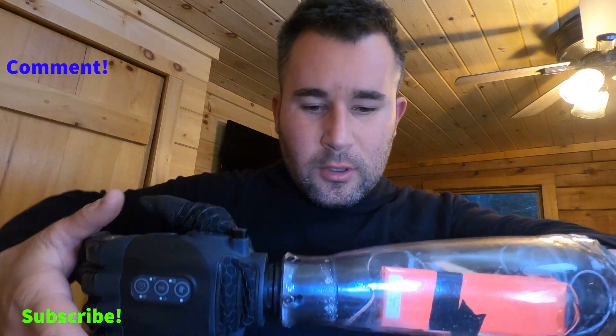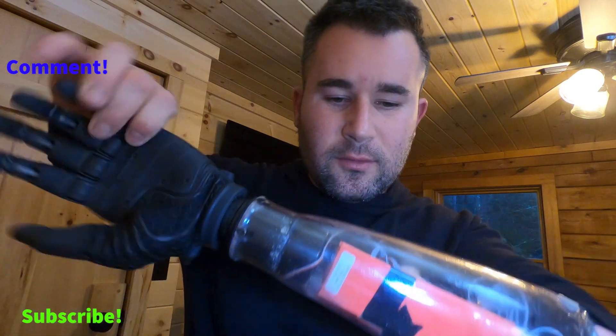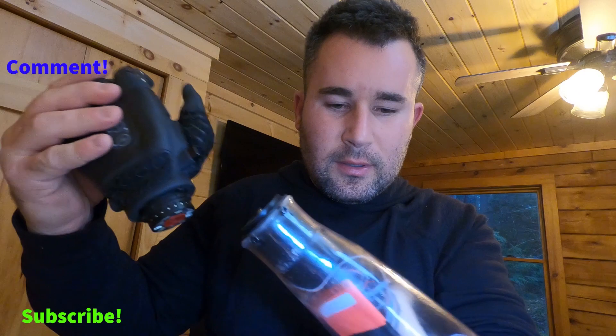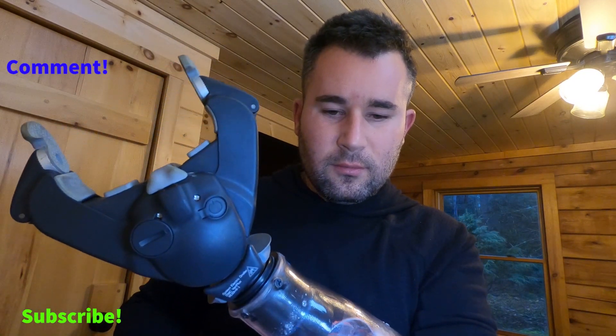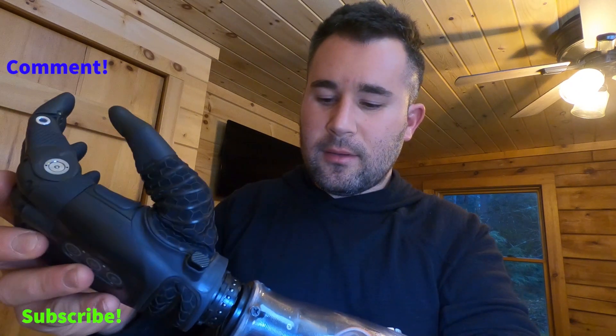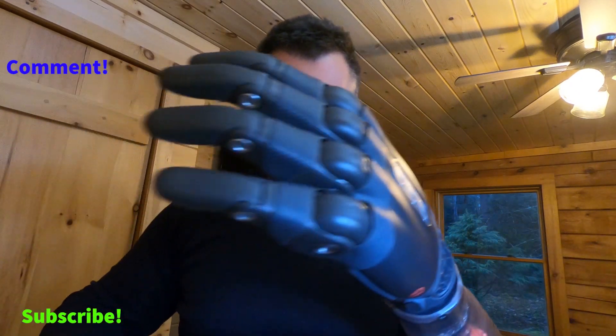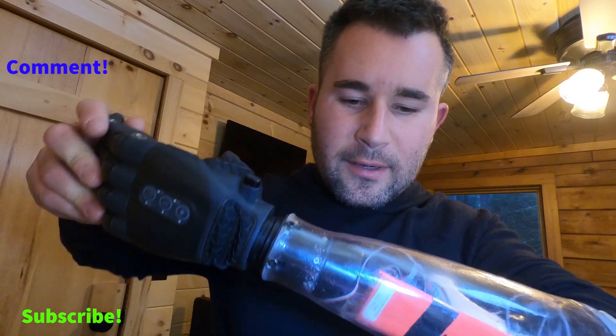The hands always spin like this because you twist them to take them off — that's how you remove them to put different attachments on. So you take it off, put a different hand on, boom. Now let's get that off and put the Tasca back on.